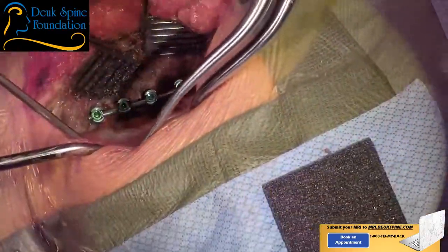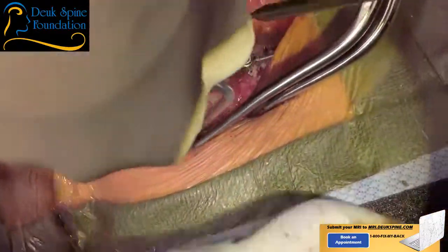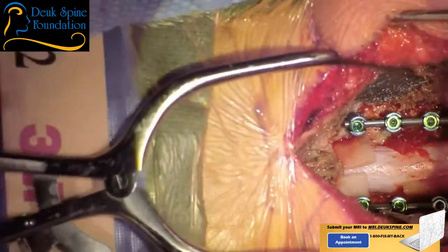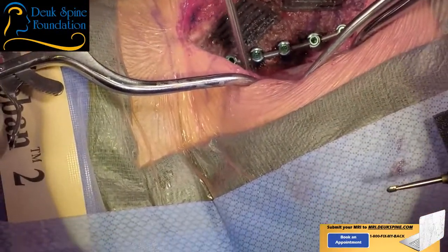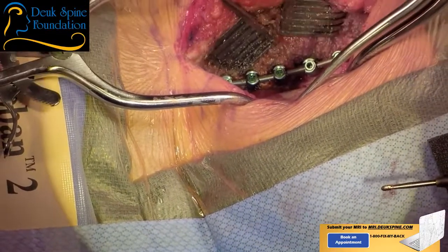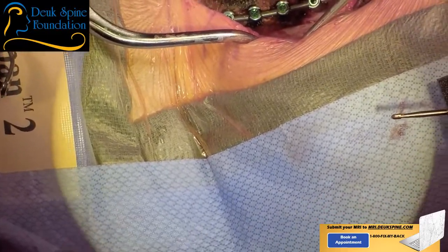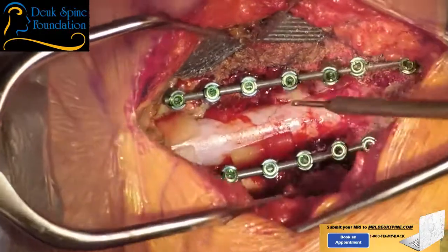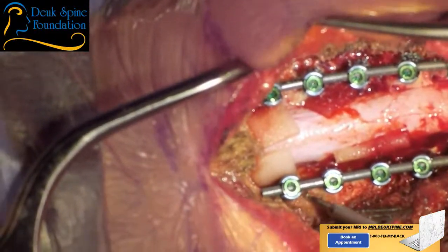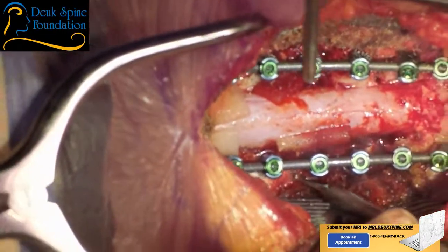All right, we're done on one side. We're going to do my side now. Let me just look and see. Okay. Wait a second. Who's moving? Are you moving the patient? No. I want to make sure she doesn't move. We've got to make sure she stays non-moving. I don't mind if you let her twitches come back, but we cannot let her move in pins. No matter what, that would be really bad. Suction, please, ahead of me.